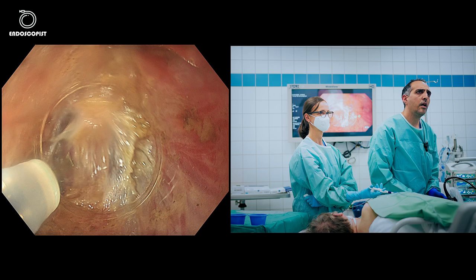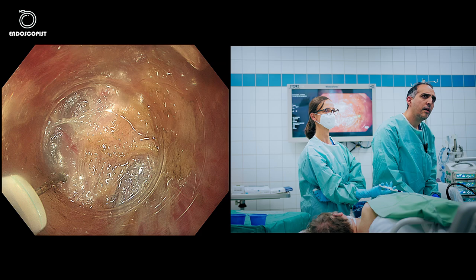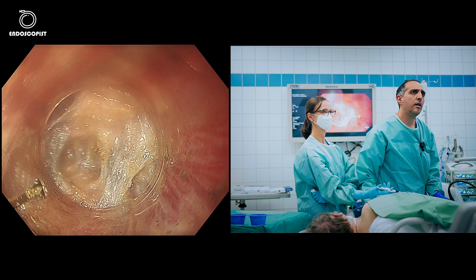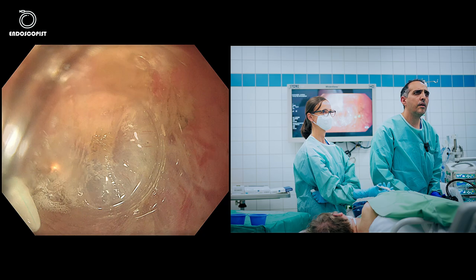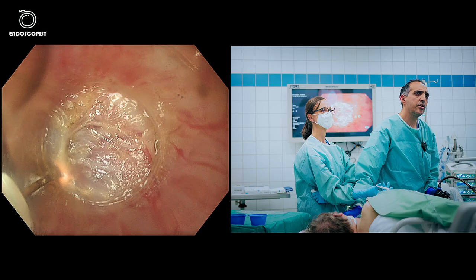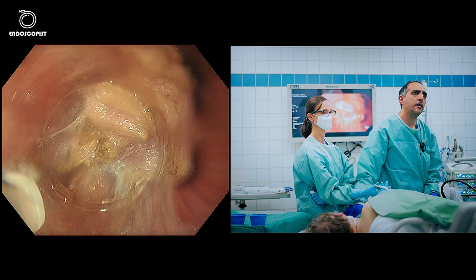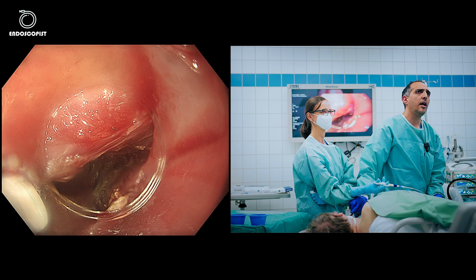I'll go deeper — there are still some fibers here. No big worries if you do a perforation here, because as long as your mucosa is intact, no complications will happen. Going outside the tunnel now to have a look — the lumen is completely opened. Looking here, I think we still have some fibers.